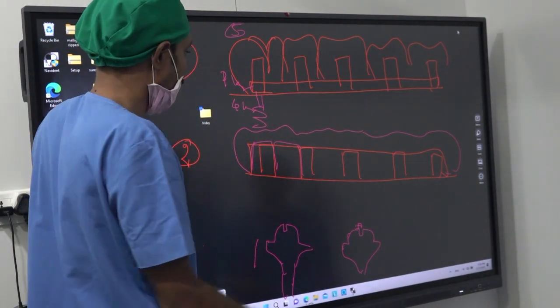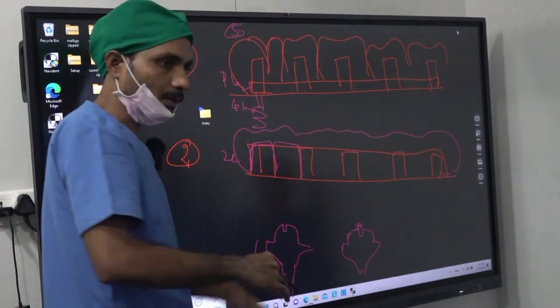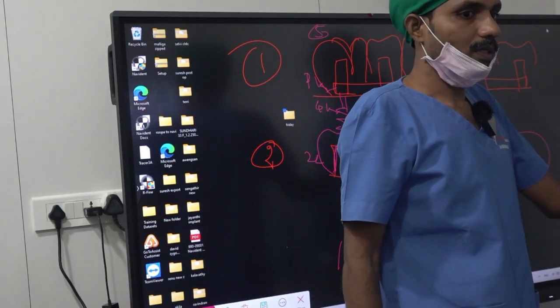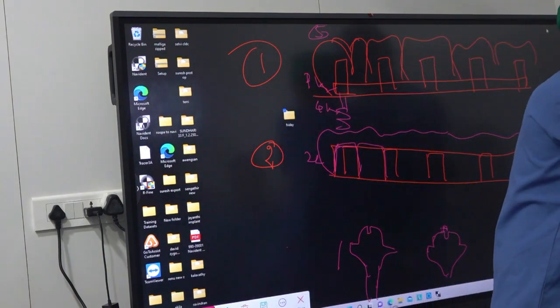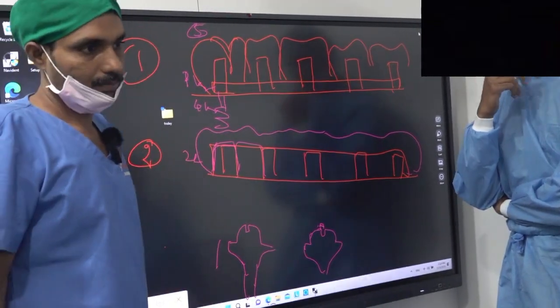and implant. Here if you give a metal acrylic process, maybe 2 kg goes into this bar because the bar holds the implant better. See, I am holding it like this. Okay, this is welding. If I am giving a metal acrylic process, this is holding like this. The process holds 360 degrees here. But here, it connects at only one point.